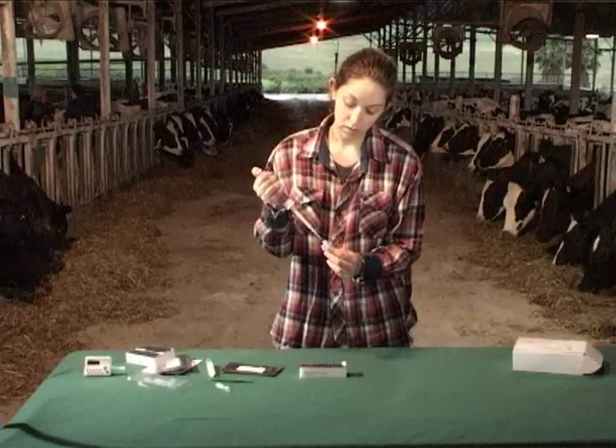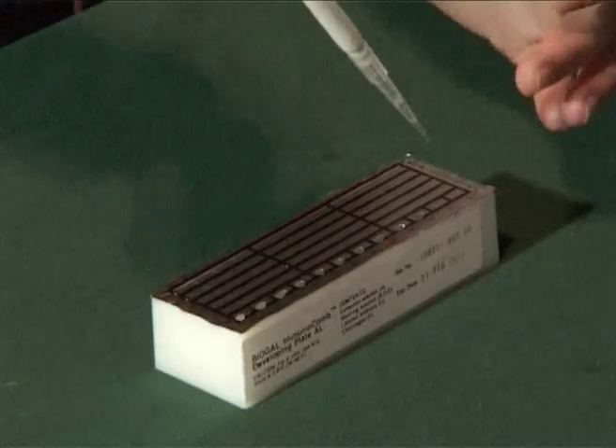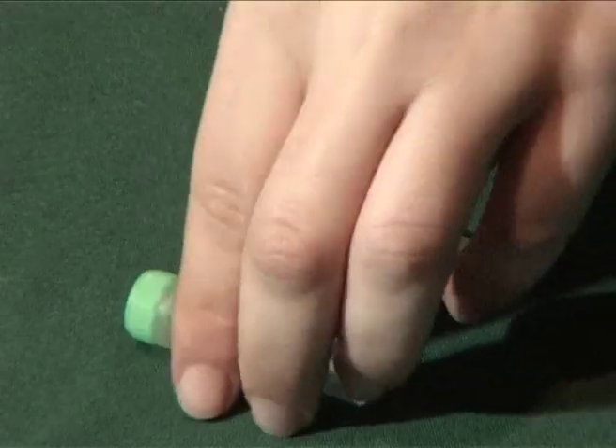For the control serum, open the next two wells. Enter 5 microliters of positive control into well A next to the last well, and 5 microliters of negative control into the last well of line A.